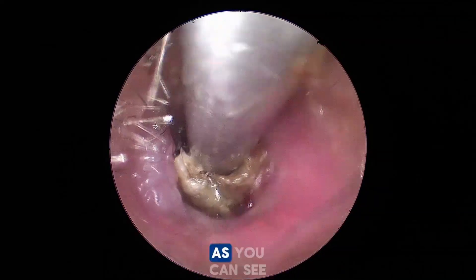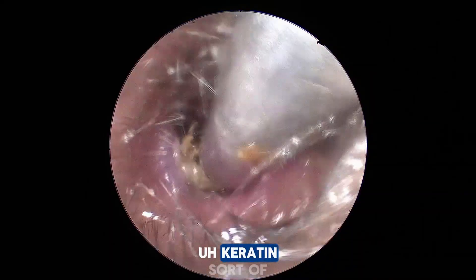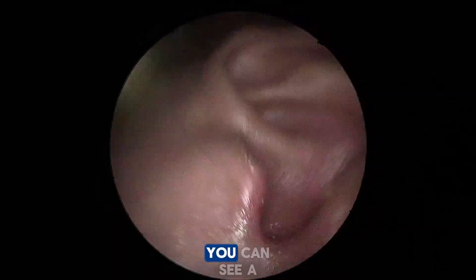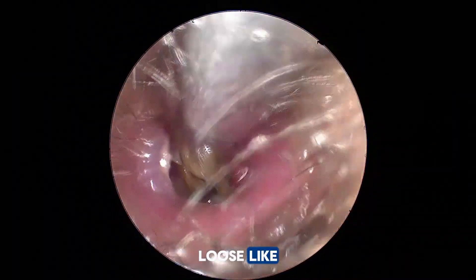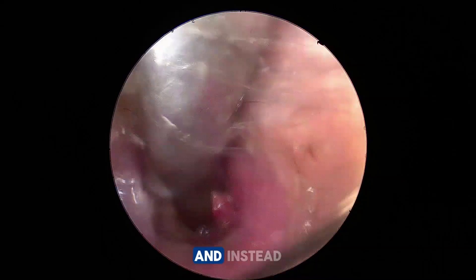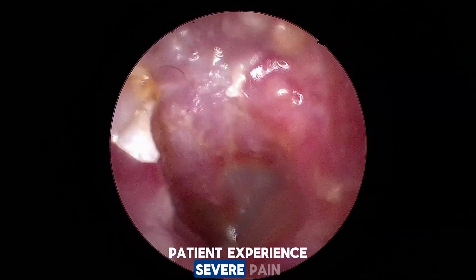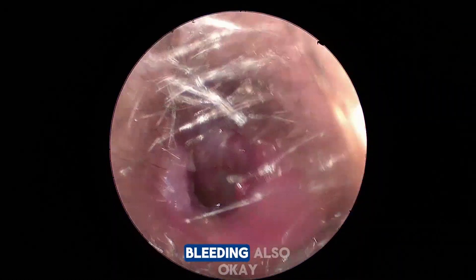Here we are proceeding — as you can see, the canal is completely filled with a dense keratin plug. You can see the surface is a bit shiny, there is a bit of discharge, and the plug is not loose like ear wax. Instead, it is very firmly attached to the underlying bony canal skin. This explains why patients experience severe pain and why its removal can be very difficult and can cause bleeding.